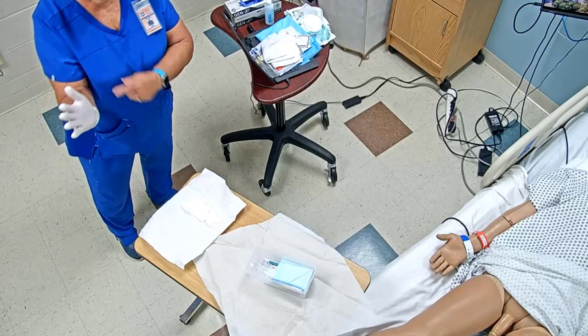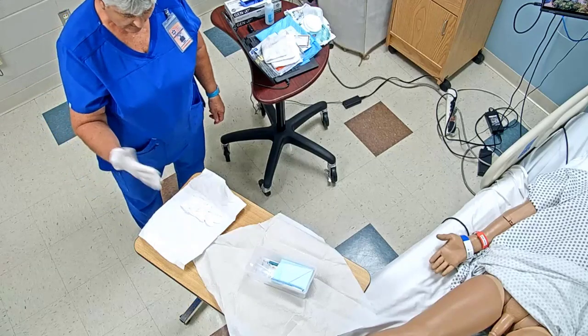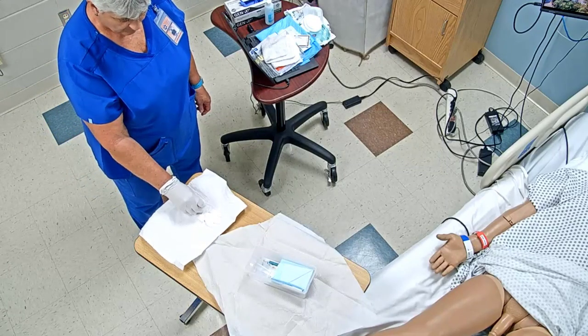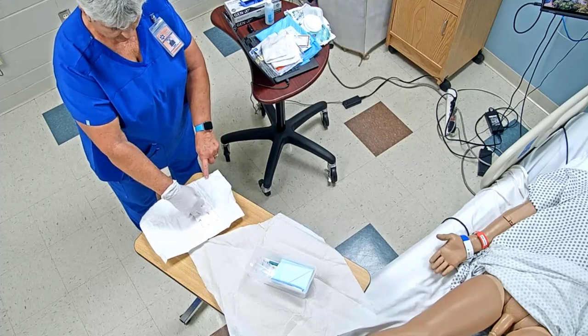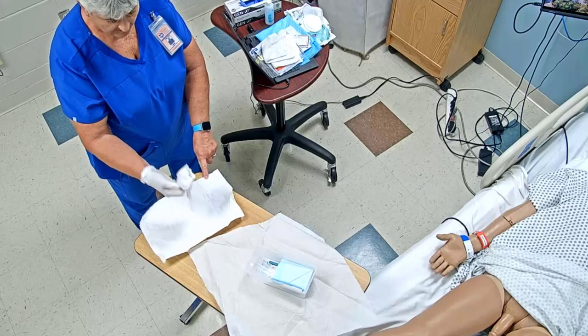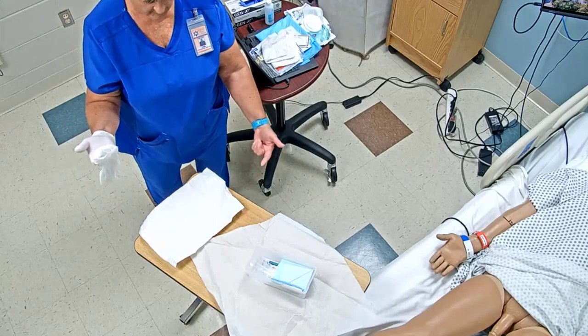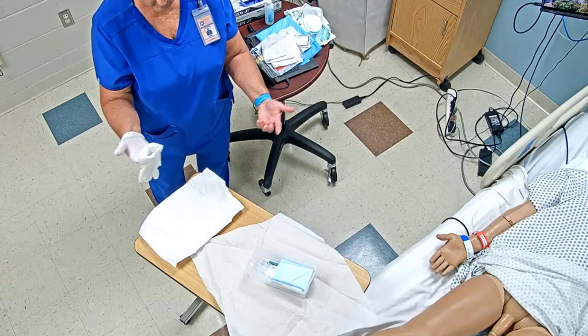Okay, once I let go, you don't want to go back to the cuff. You've got a 1-inch border now. Now I'm sterile to sterile, sterile over sterile, sterile to sterile. So I'm going to pick this glove up so it doesn't move around, okay? Now I did notice that when I opened this, I did go over that, but I changed, so I know that I can't touch that with my sterile gloves.